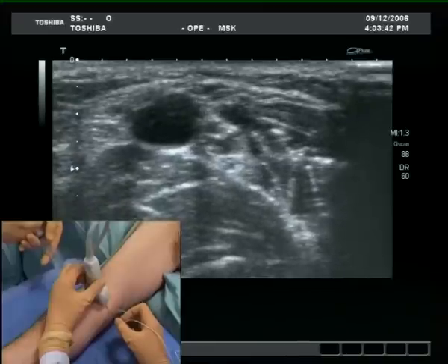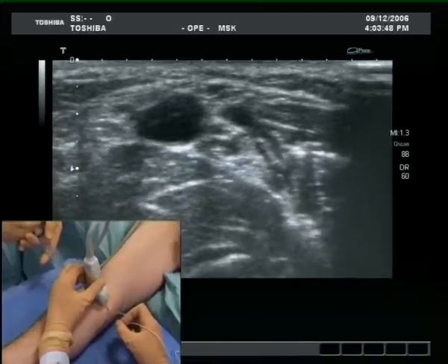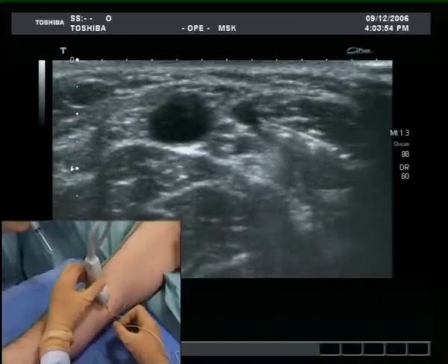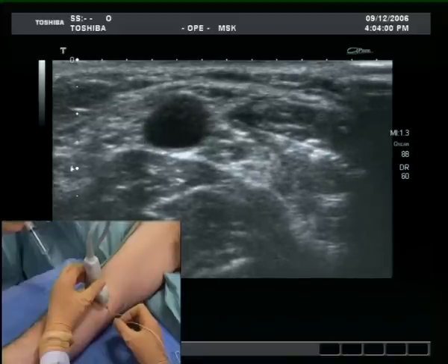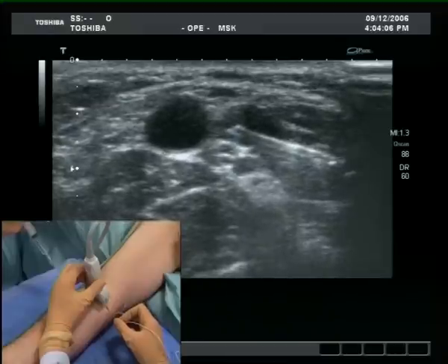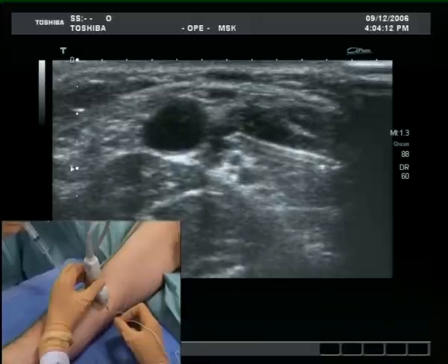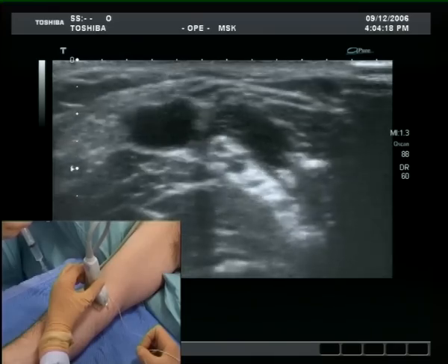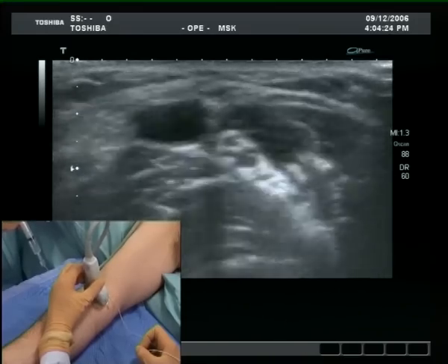Note the spread of local anaesthetic over the medial and anterior aspect of the nerve. The total amount injected in this clip is of the order of 4 millilitres. Moving the probe up and down confirms satisfactory spread along the long axis of the nerve and reassures the operator of the success of the block.